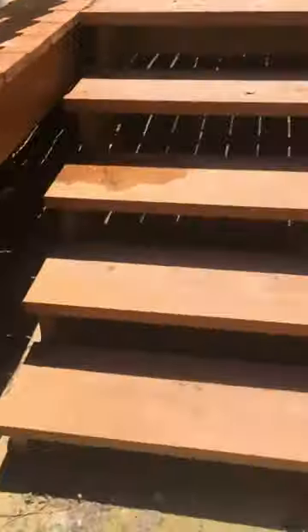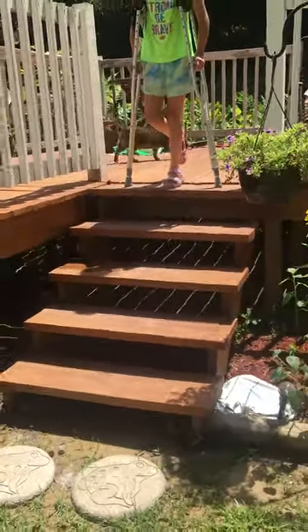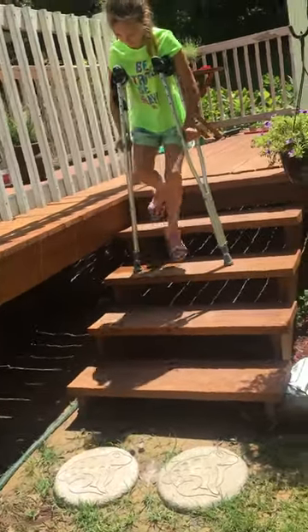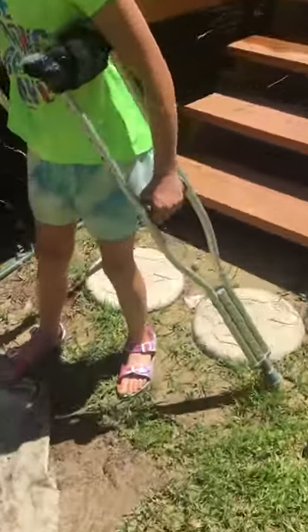Now let's go up and down stairs. Let's go down the stairs first. She practices a lot. You put the crutch first down and then you hop down. Oh, you got it, T.